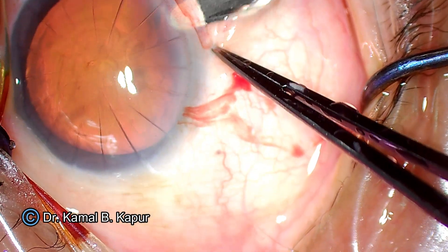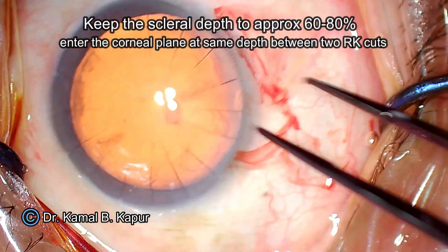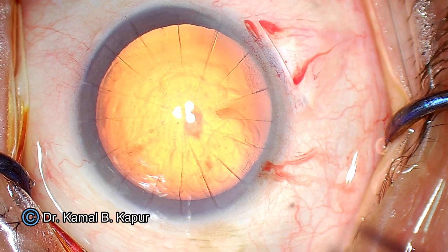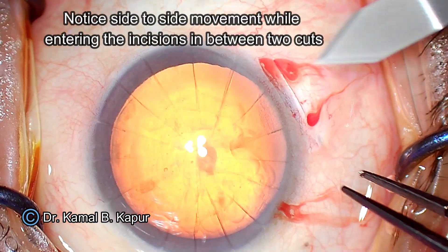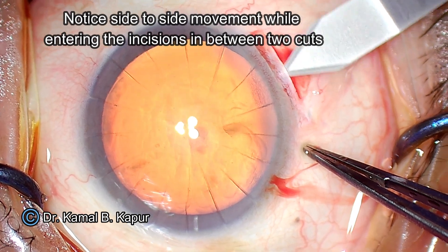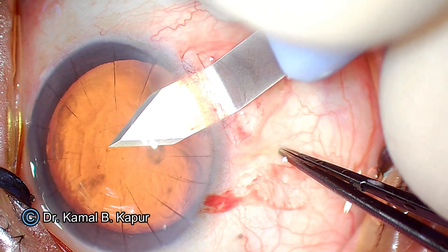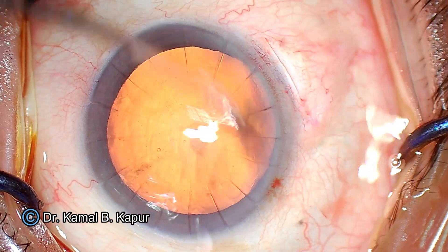Make sure that side-to-side movements do not lift the cornea, because this may also cause a tear in the cornea. Once this is done, before you enter with the 2.8 keratome in the same plane, do side-to-side movements. This ensures that you are entering the same plane which your crescent blade made. Now we have a clean entry into the anterior chamber.